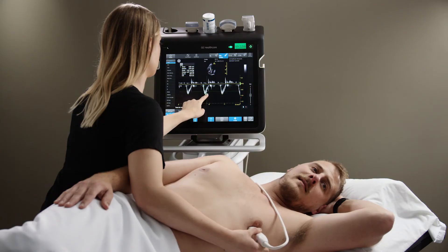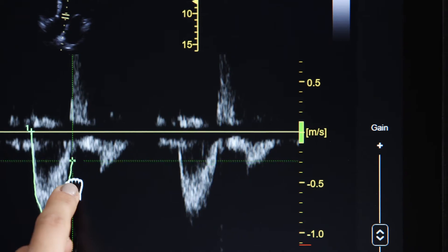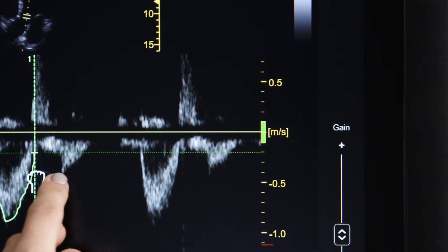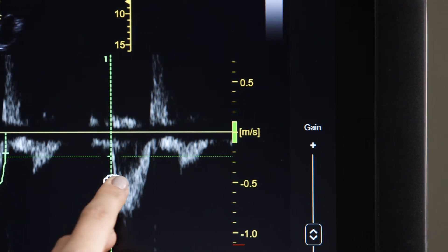Without the Auto VTI tool, you would need to take several measurements and images to calculate the VTI.